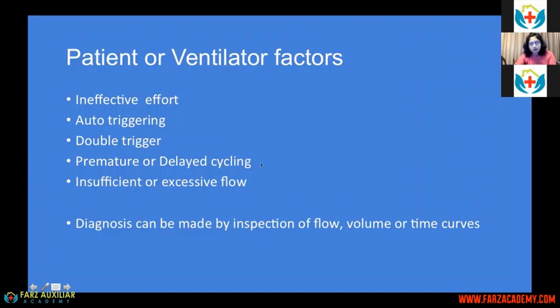Most of you would have learned by now that when a mechanical ventilator is set, there is a cycle of inspiration, pause, and expiration, and in the process, gas flow is also set. Various modes of ventilation have their own initiation or limiting factors. This cycling is also set by the ventilator.